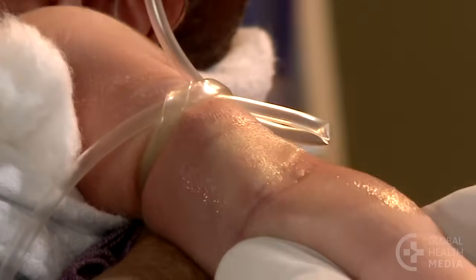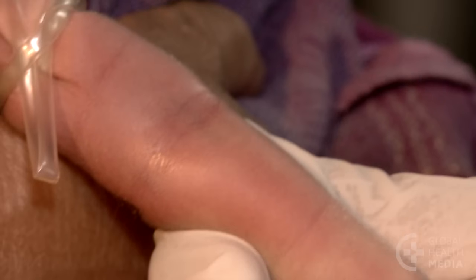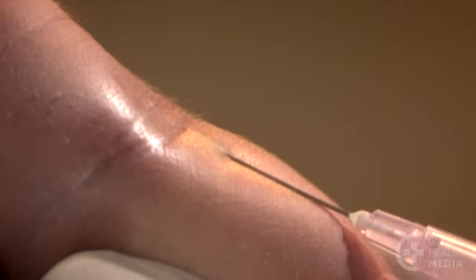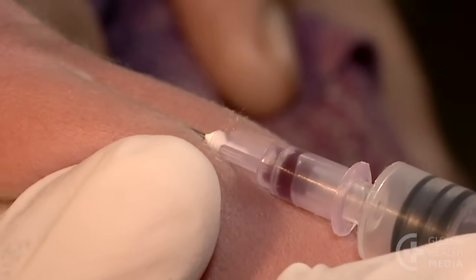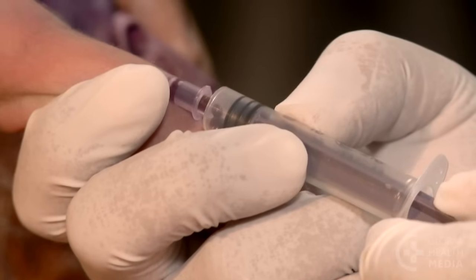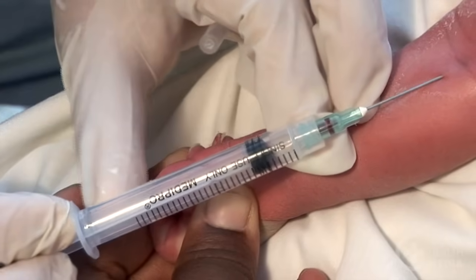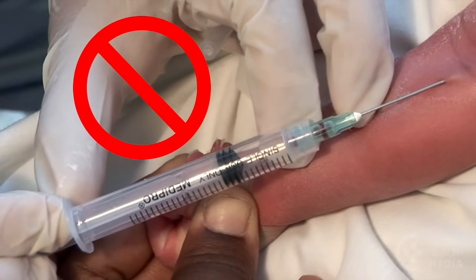Let it dry. Stretch the skin and hold it firmly, then insert the needle through the skin. The flashback of blood shows that you're in the vein. Pull back very slightly on the syringe and then continue to hold. Let the syringe slowly fill — be patient, as pulling back too forcefully will collapse the baby's tiny veins and you will not get blood.